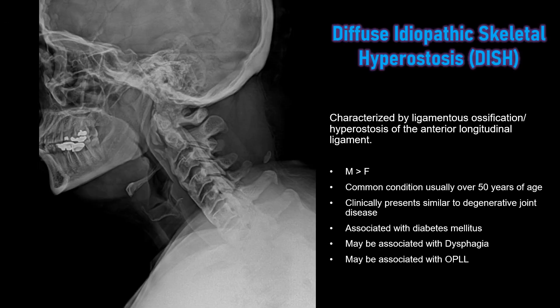On this lateral cervical image you'll see thick flowing hyperostosis within the expected area of the anterior longitudinal ligament, and that's consistent with diffuse idiopathic skeletal hyperostosis (DISH). Posteriorly there's also ossification of the posterior longitudinal ligament, and this can cause neurologic symptoms and canal stenosis.